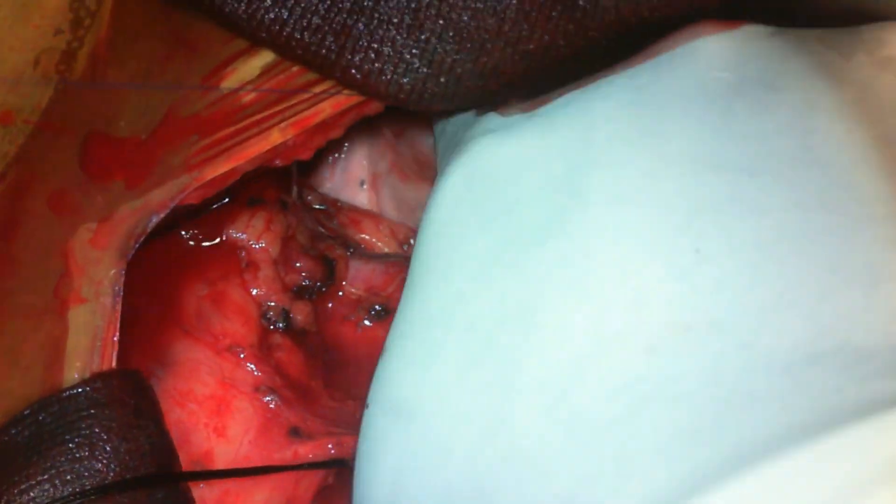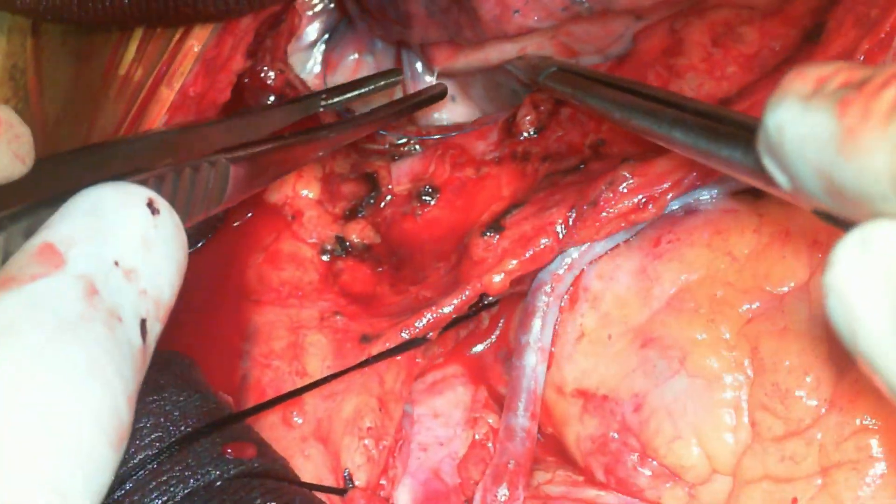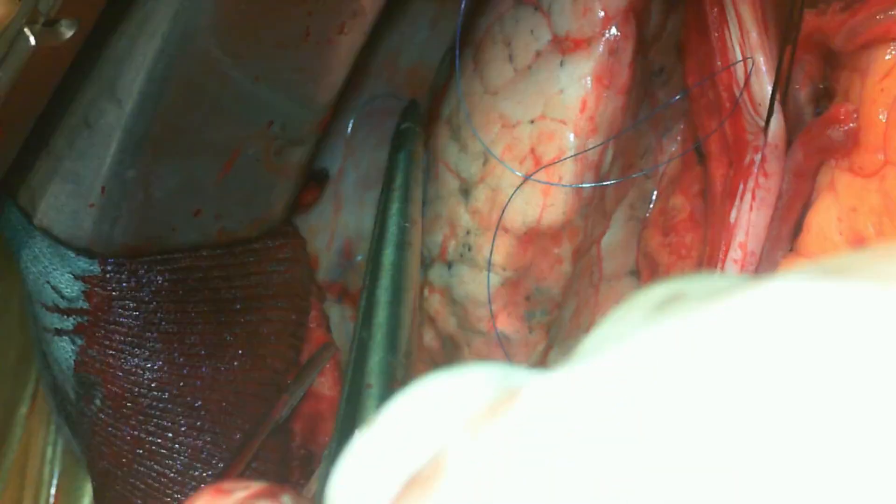This is especially relevant with a PEEP of four or five, which is quite physiological. You can fix the lung at two places, taking deep bites within the lung parenchyma and fixing it to the chest wall.